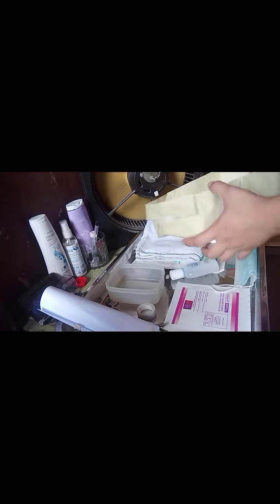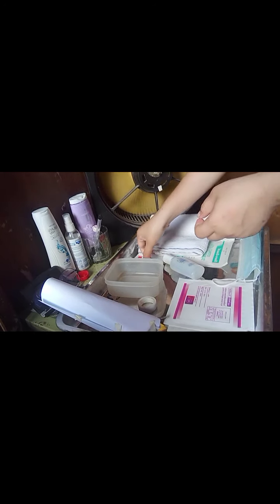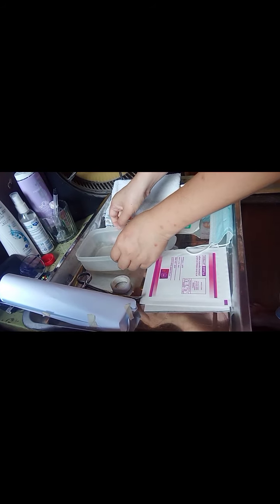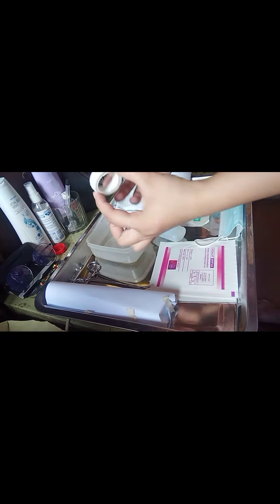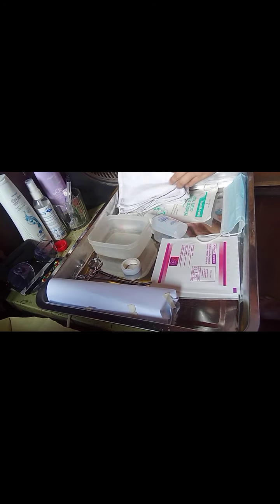So, I have here the waste receptacle, the antiseptic wound solution, the antiseptic ointment, the kidney basin, the sterile forceps, the sterile swabs, the tape, the sterile gauze pad, the blanket, the face mask, and the sterile gloves.